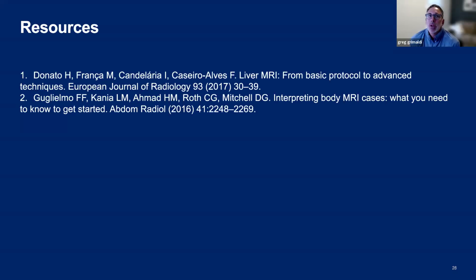Yeah, so what I like to do, it's a little bit different at each institution. I'll tell you what we did at my former institution. Sometimes it can be really hard with small hemangiomas to identify, because hemangiomas are not lesions that are of liver origin and therefore won't take up the agent. So I always like, as a general rule, having one MRI that's done with an extracellular agent to define the lay of the land, characterize our hemangiomas in the liver, and then if patients are going to plan surgical resection, to move on to EOVIST to give the lay of the land.